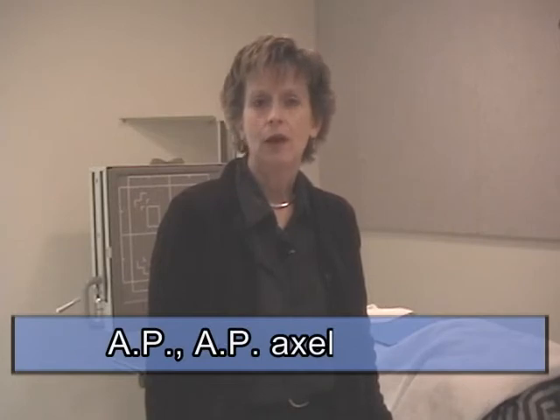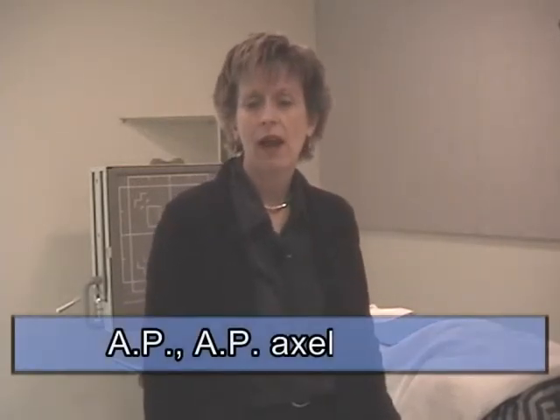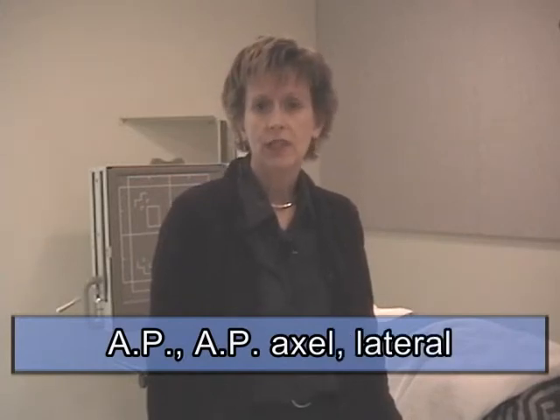A partial skull would consist of an AP axial. Some techs who have trained in previous years may refer to that as a Town. Newer textbooks will refer to it as an AP axial. And then we will do a lateral. For a full procedure, you would do an AP and a PA, an AP axial, and both laterals. That would be the difference.